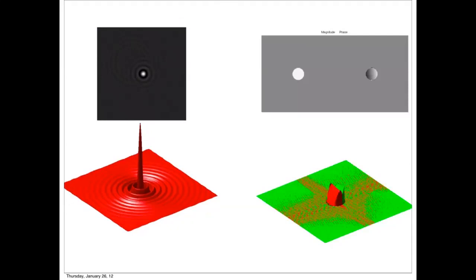And then if I shift the jinc from its center, the effect is that it's going to have a linear phase in the frequency domain. So now this is the real, this is the magnitude, and this is the phase. These are basically two images, one phase and one magnitude. The magnitude is constant, so nothing has changed in the magnitude. But now there is a linear phase across it because the jinc was shifted. And this is the real and imaginary parts overlaid on top of each other.